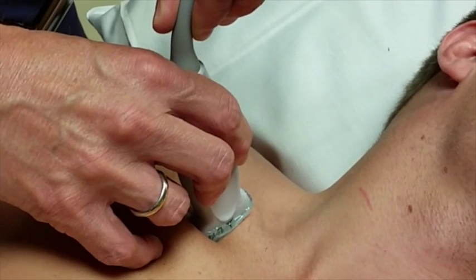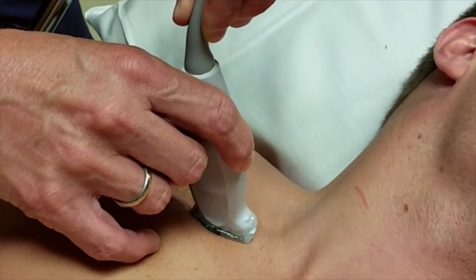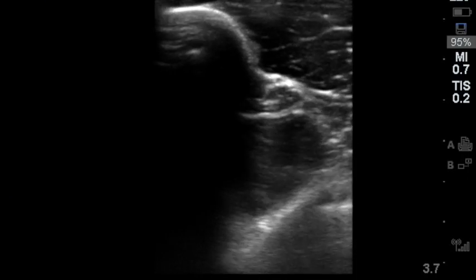Stop your probe at this junction and very slowly rotate the probe using two hands to bring this vessel into long axis orientation. This is difficult, so keep your eyes on the machine and move slowly.